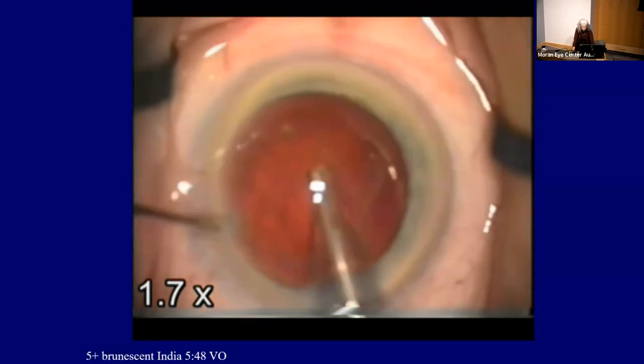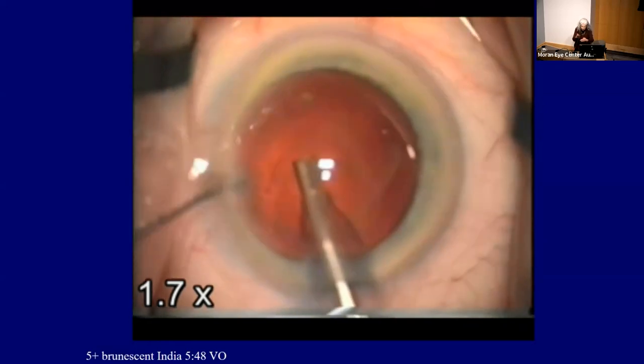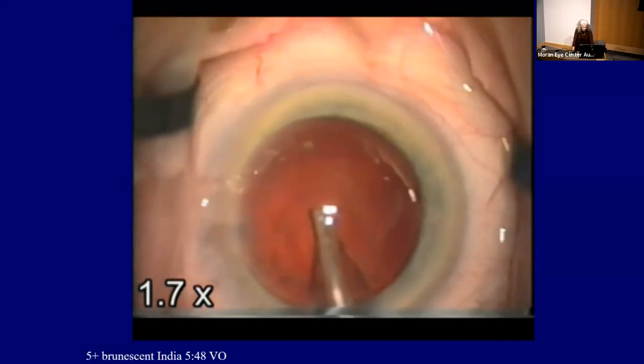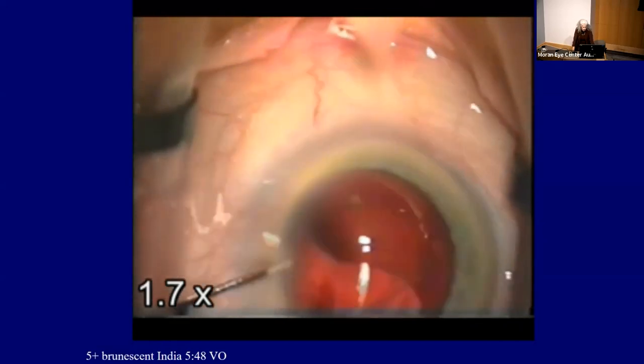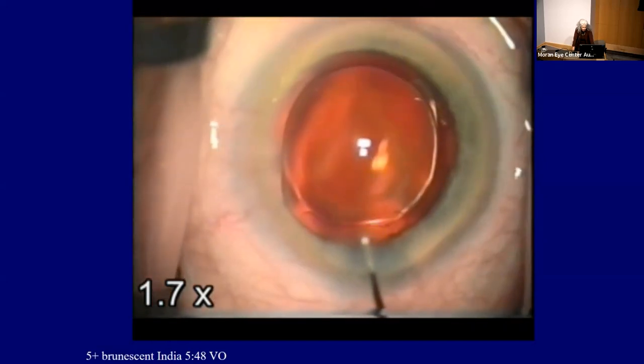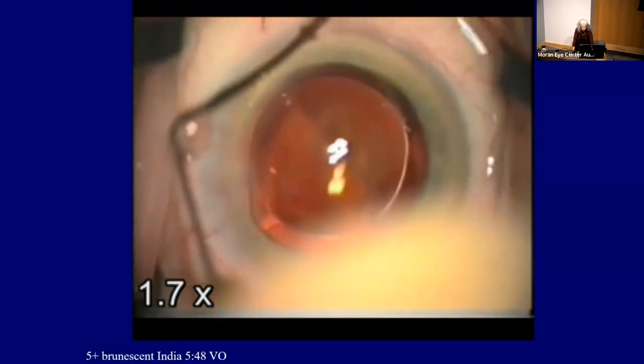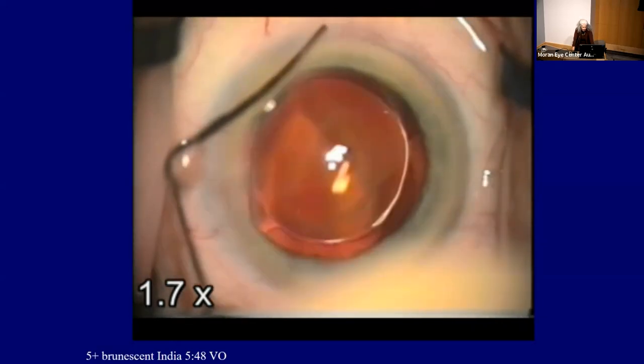So you'll hear, and then before I go, ch-ch-ch, I'll have the secondhand instrument underneath. I always like to put BSS in the chamber, kind of like a chamber maintainer when I remove anything, so the chamber never collapses. And you'll see at the end of the case, everything is clear and lovely. And that's a very typical case in my hands.